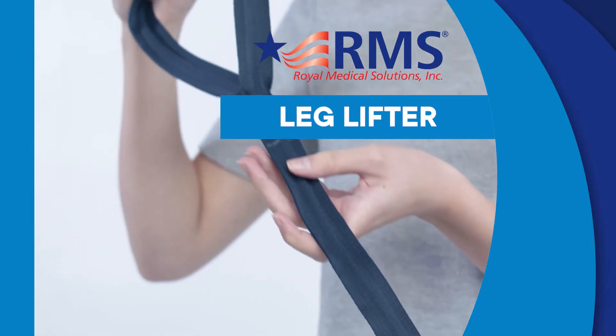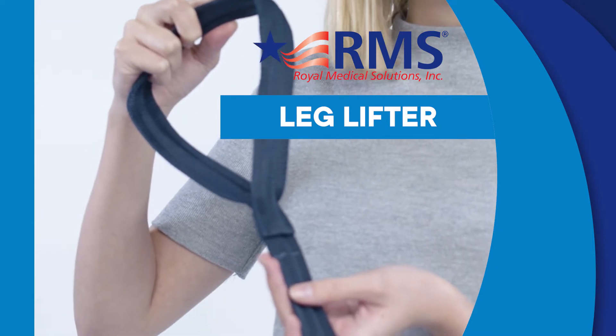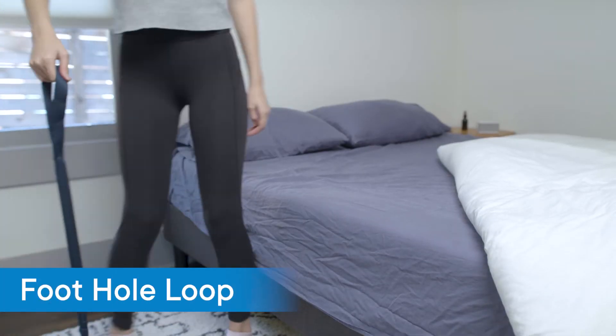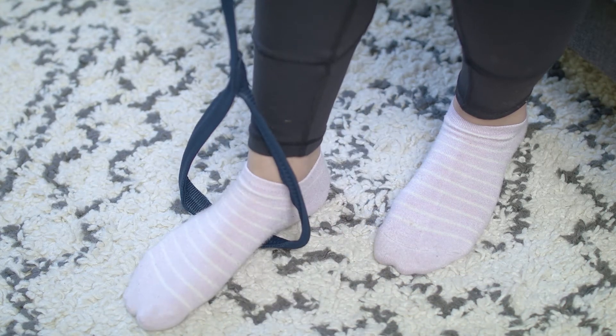The leg lifter from RMS allows you to easily maneuver your legs and get out of chairs, wheelchairs, beds, or cars using this convenient leg lifter strap. It features a large open foothold loop to help pull and lift your leg or cast into position.